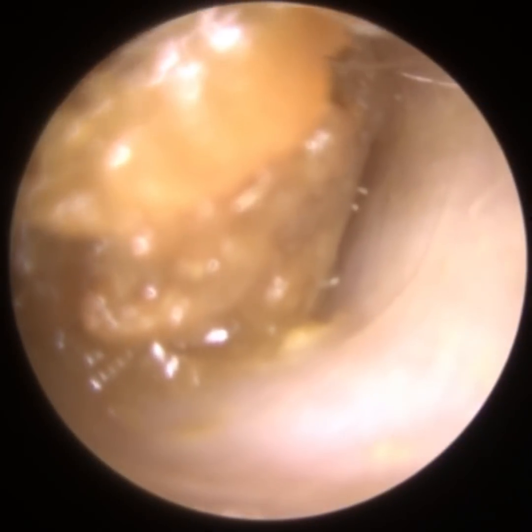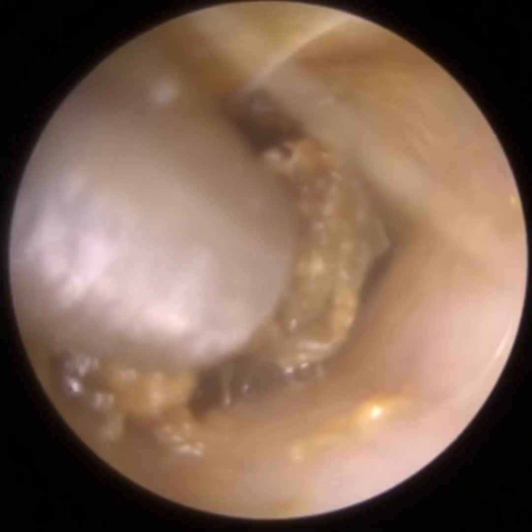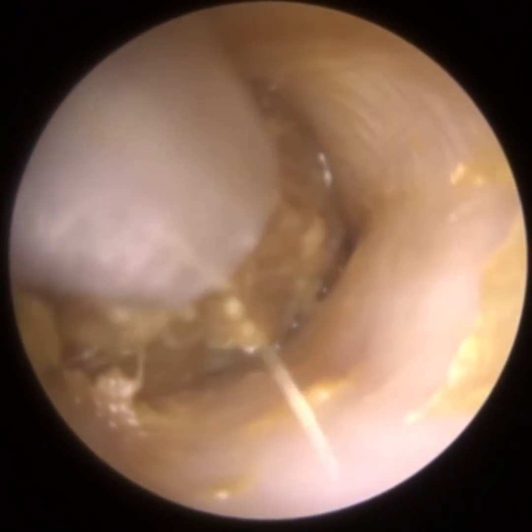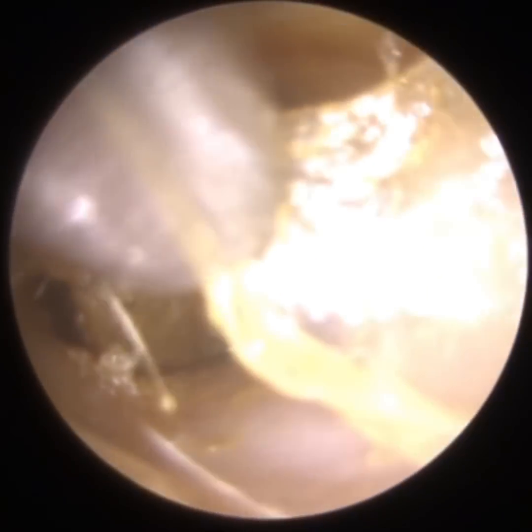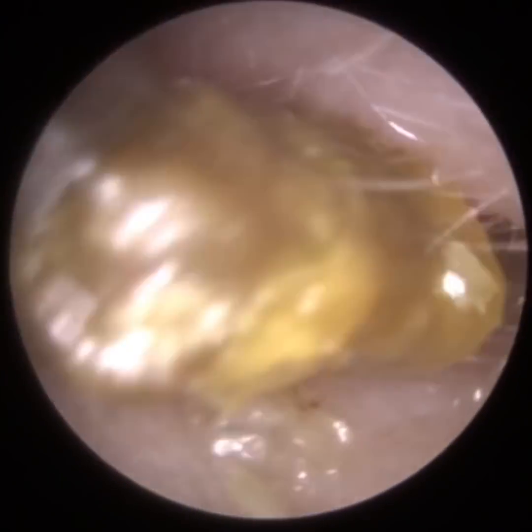So the pinna is the external cartilage that looks like a satellite dish. If you retract that back and up, not only do you widen the ear canal, you straighten it. I then insert the eye clearscope endoscope into the ear canal, using it almost like a door stop to keep the canal wall open ajar, which then enables me to safely insert the suction probe.